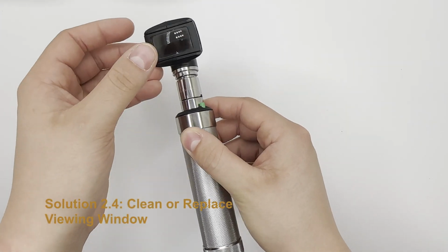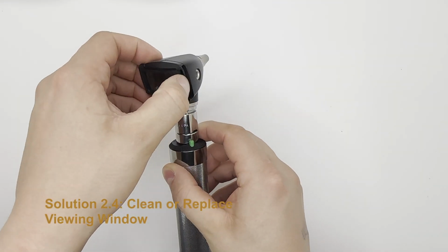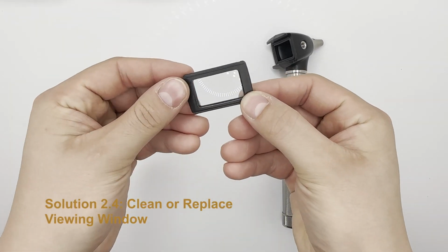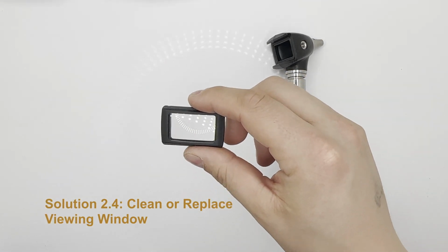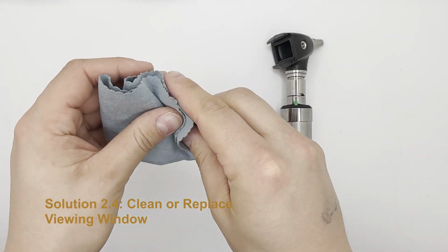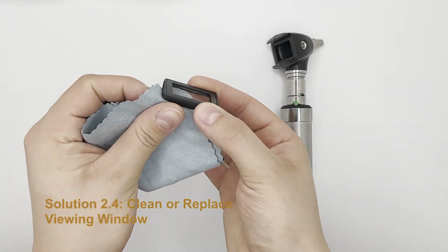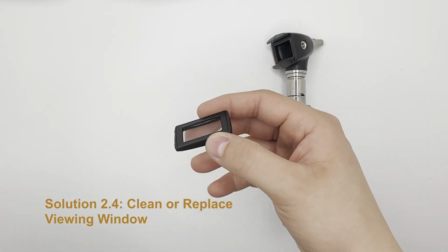Both scopes have a viewing window on the back of the head that can become dirty or foggy. The otoscope viewing window can be removed and cleaned with an alcohol wipe. The ophthalmoscope viewing window cannot be removed, but one side of it can be cleaned with an alcohol wipe. If this doesn't work, the viewing window might need to be replaced.